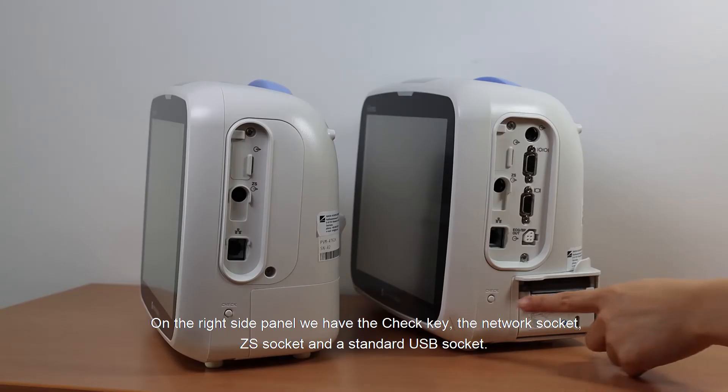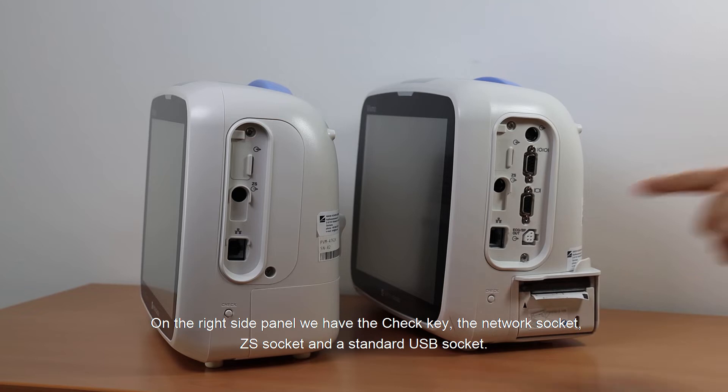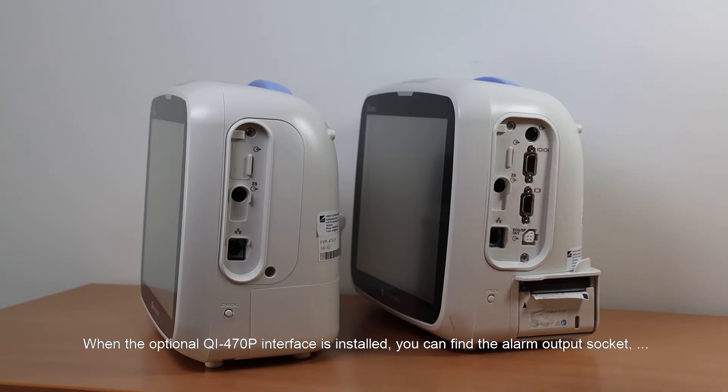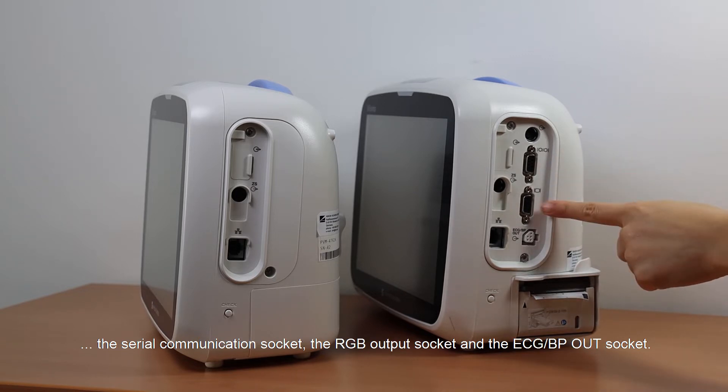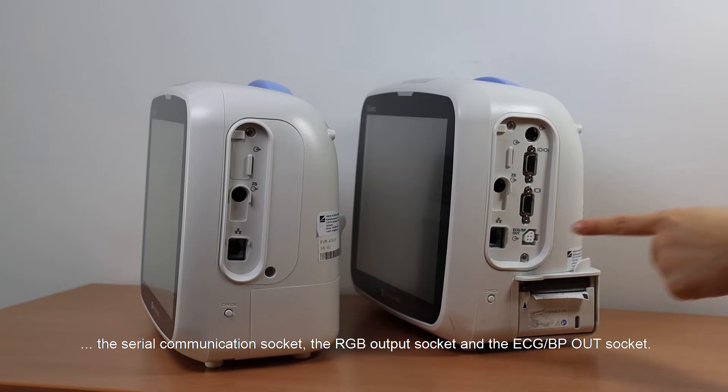On the right side panel, we have the check key, the network socket, ZS socket, and the standard USB socket. When the optional QI-4770P interface is installed, you can find the alarm output socket, the serial communication socket, the RGB output socket, and the ECG/BP OUT socket.